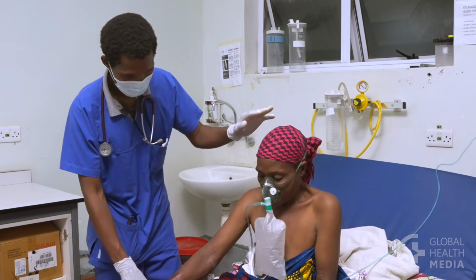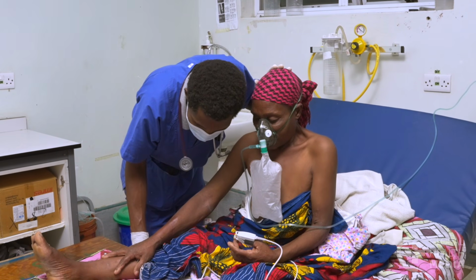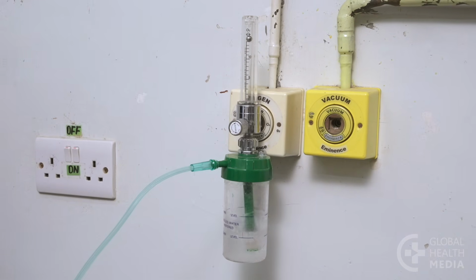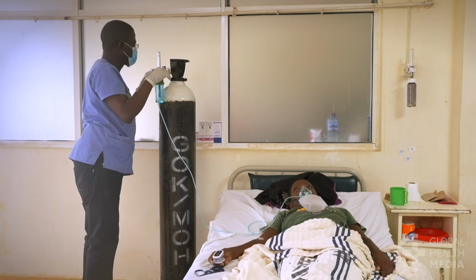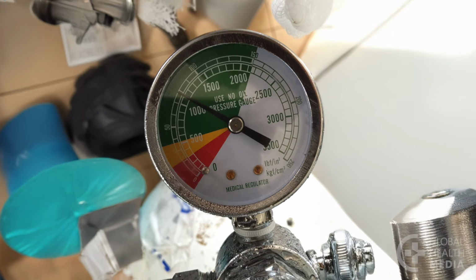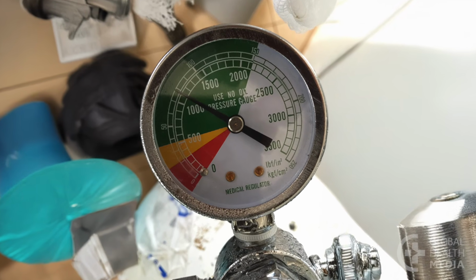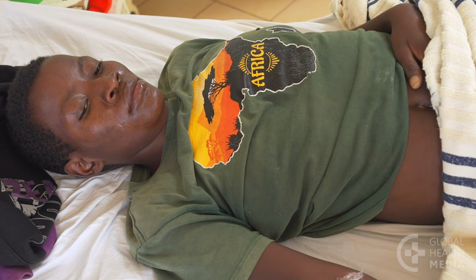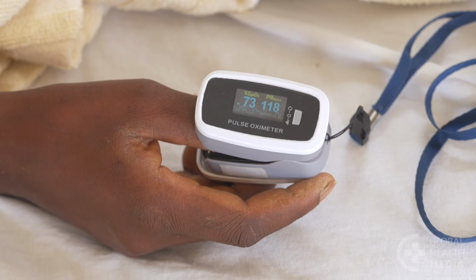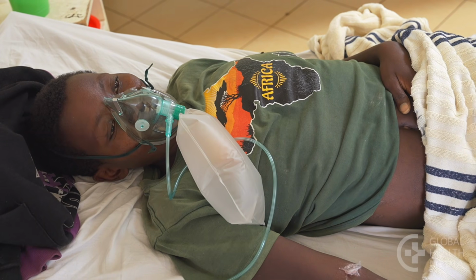With each step, check that the oxygen is flowing, the equipment is working correctly, and if you are using a cylinder, that the pressure gauge shows there is still enough oxygen in the tank. For patients who present in extreme respiratory distress with a very low oxygen level, start directly with the non-rebreather mask.